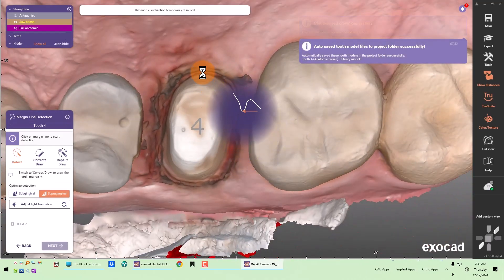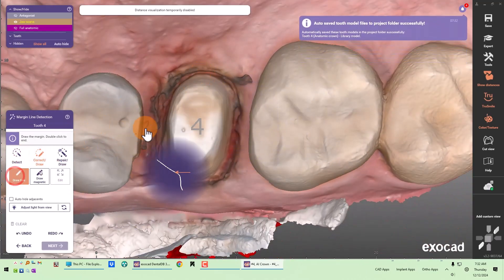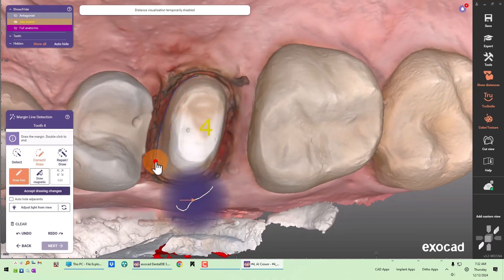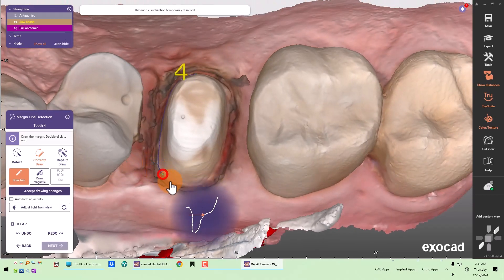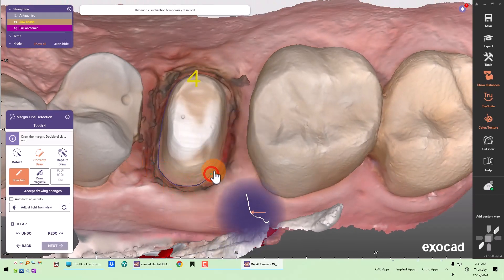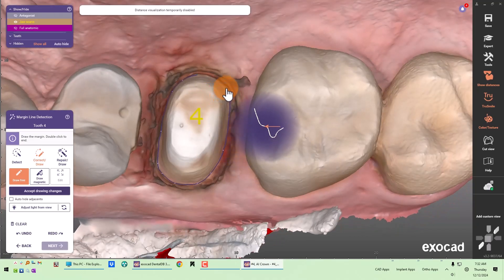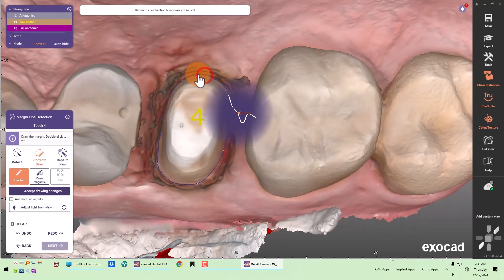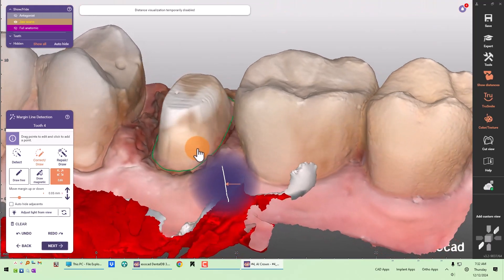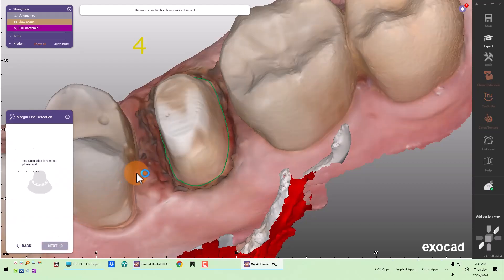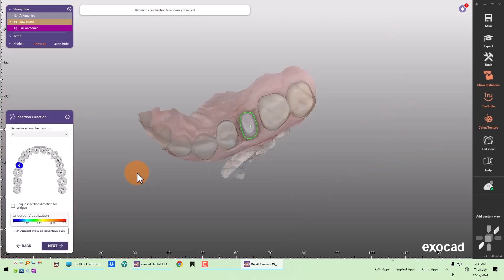The crown is back. Again, I'm just going to marginate. Set my insertion direction — that's pretty good.